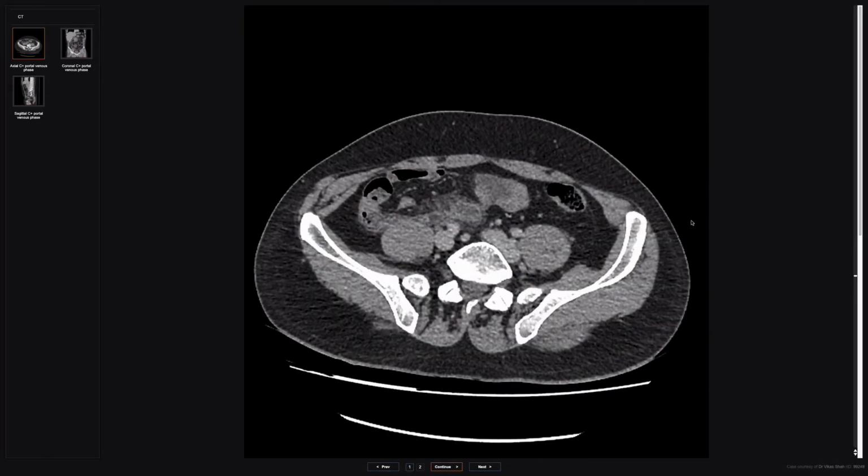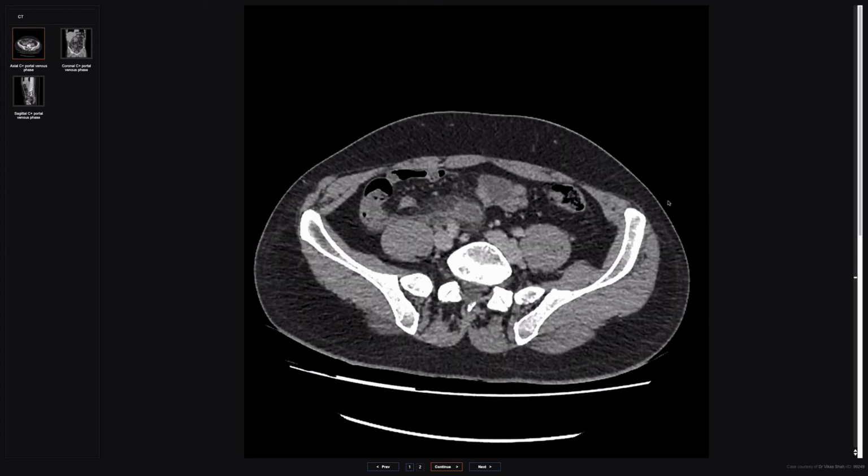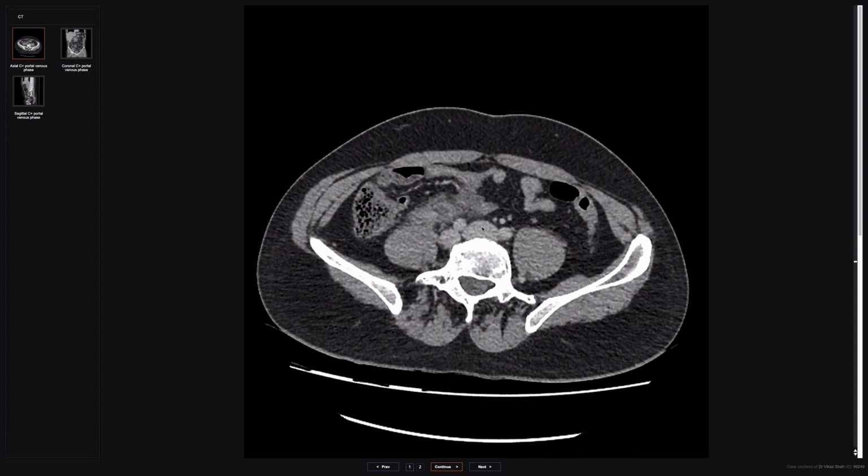And then finally, there is a soft indication of differentiation of ileus versus mechanical obstruction. And there's not enough data to recommend this as a definite indication. So here's an example of someone who came in with acute appendicitis.